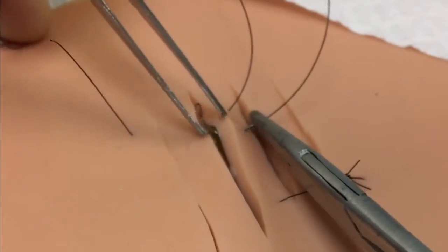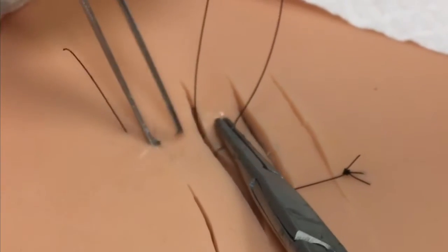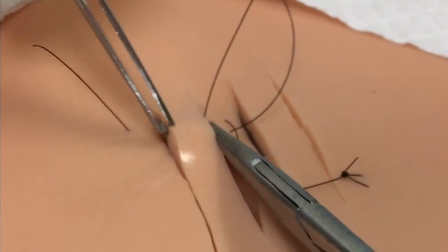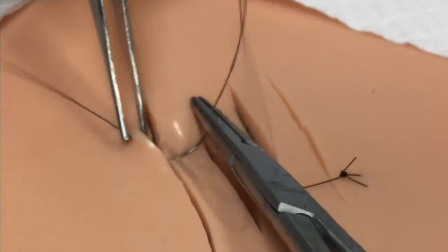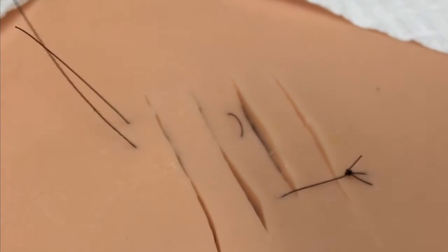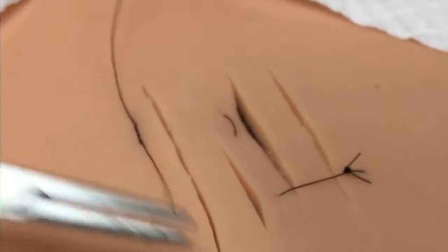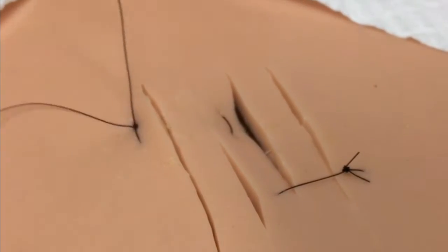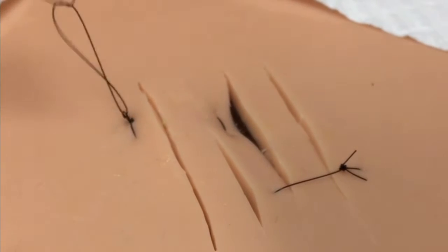You'll go through the epidermis, through the dermis of the intervening tissue island, and then finally through the dermis and out the epidermis on the original side. You'll then tie off the laceration on the same side of the wound. The benefits here involve increased precision and control over approximation of the tissue island, but it can pull on the far end of the wound and cause some puckering, which can be a problem when dealing with multiple parallel lacerations.